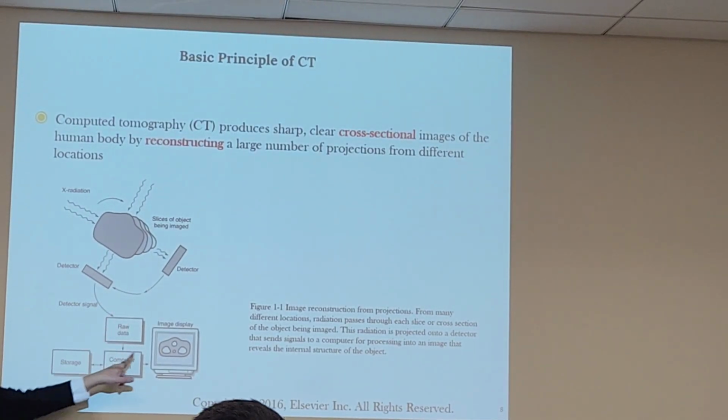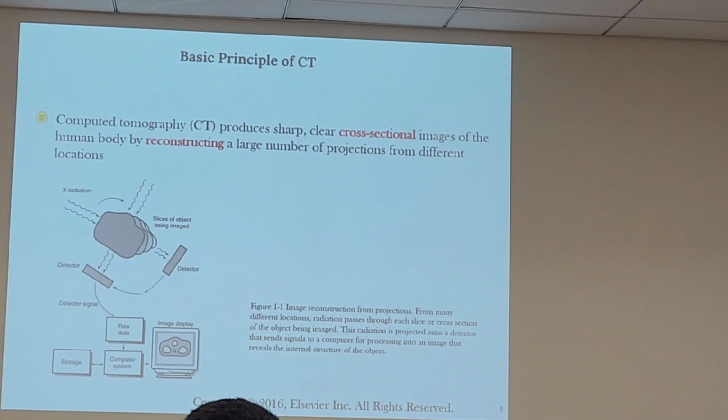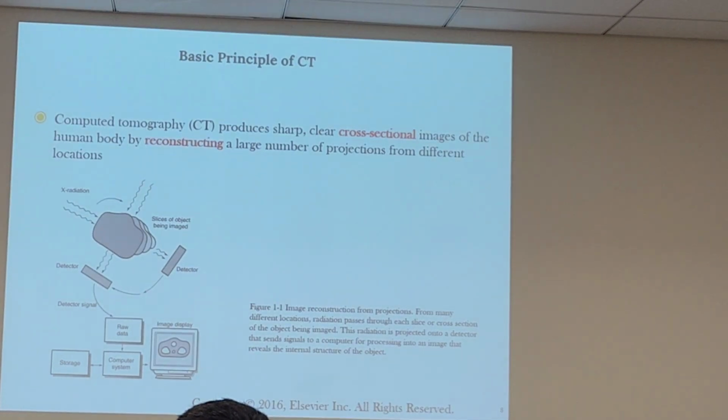It is now considered that raw data. So what's the next step to get to an image display? What do you think that's going to be? Because raw data doesn't come over and show me a pair of lungs or a heart or any of those different types of shapes. So what do you think we need next in our three-step process?